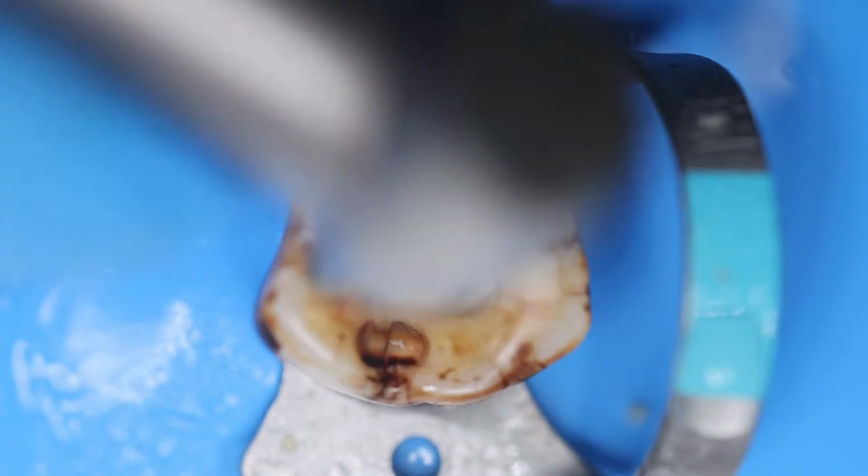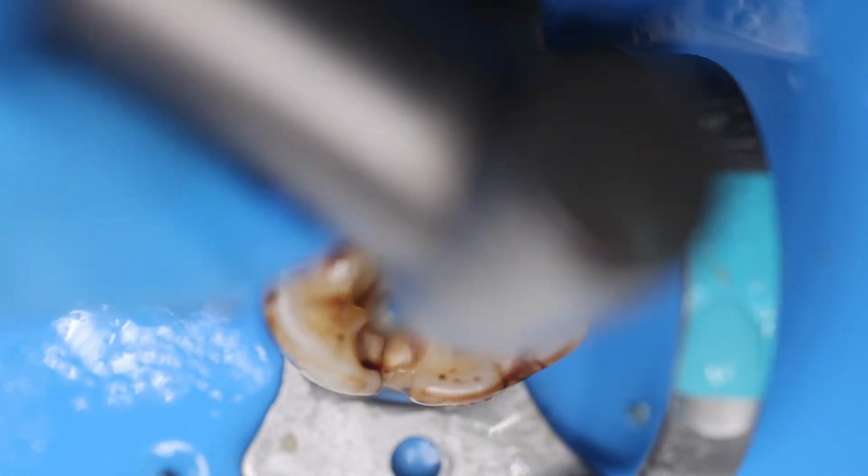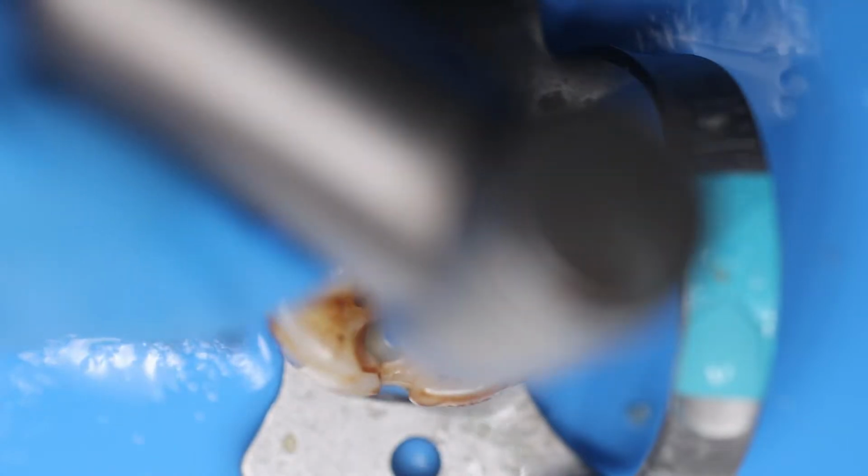Try to get the caries free tooth so that you don't have any caries left over. This is one of the principal aspects of access opening, that you should remove all the caries and have as much sound tooth structure left with a proper straight line access. All these areas can be rebuilt once you have done with your endo treatment, or pre-built before proceeding into the root canal.